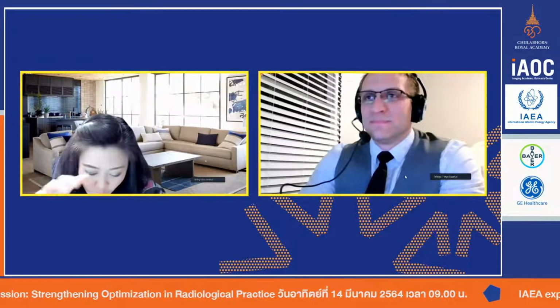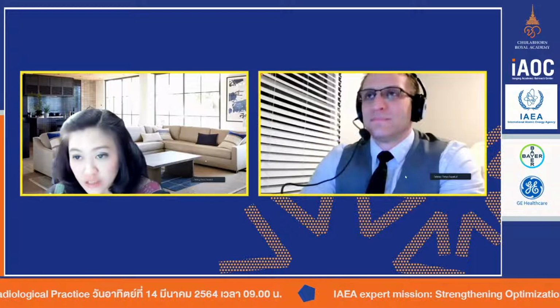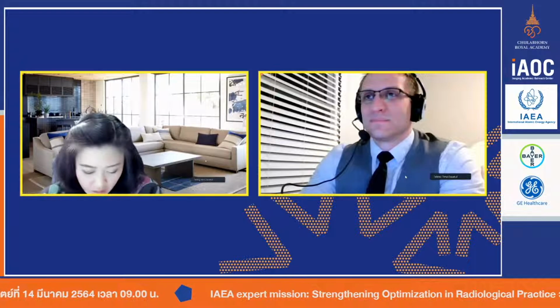So you talk about techniques like wide angle axial, helical fixed mA, and also helical tube current modulation, right? And you talk about the fastest one being the wide angle axial image at about 0.2 seconds. And how about the other techniques, like 0.3 seconds or something?